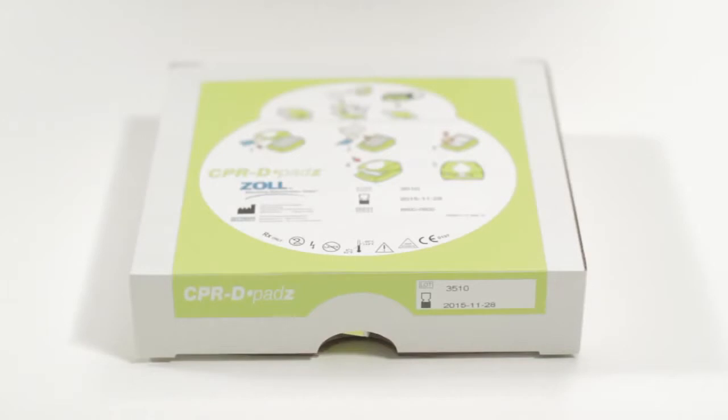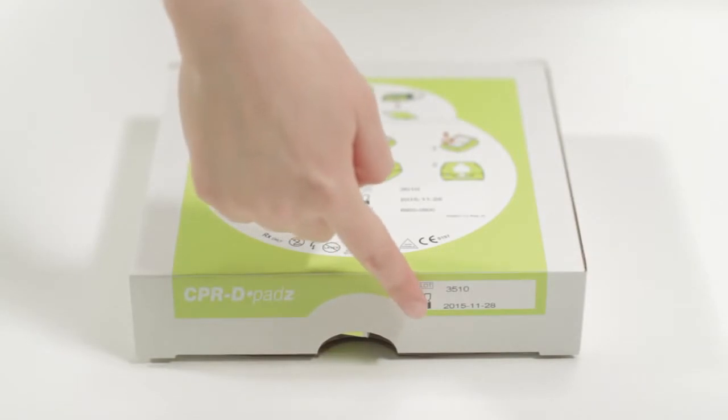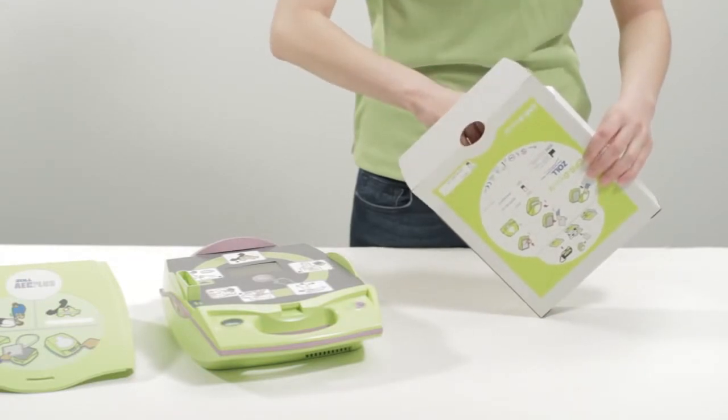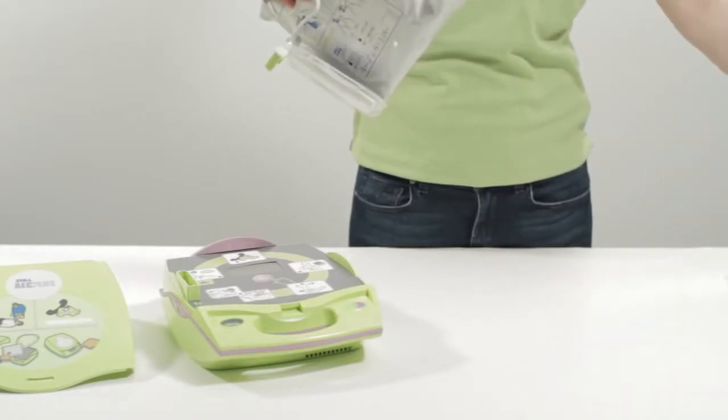Now we will install the CPRD pads. Begin by checking the pad's expiration date, shown on the expiration labels on the box. Make certain this date has not passed, which would mean the pads inside have expired. Open the box. Gently remove the entire package and set it onto the face of the AED Plus.